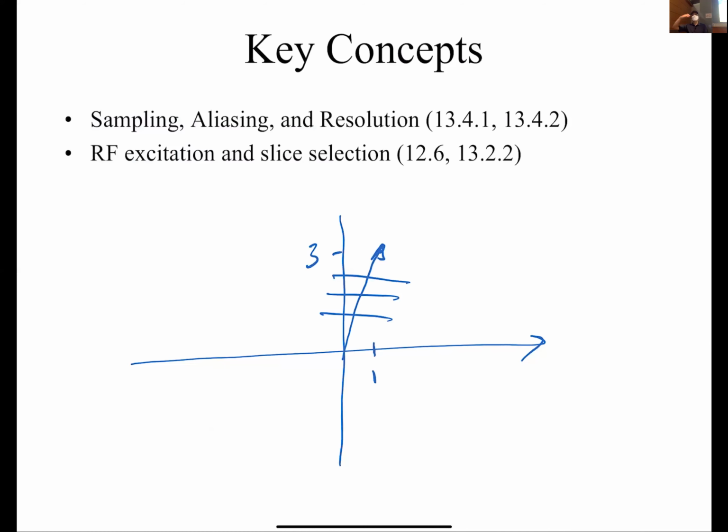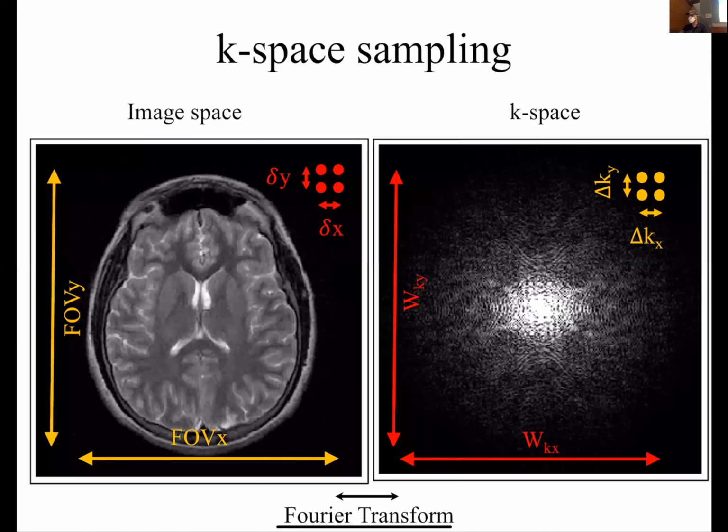That's not the right angle interference pattern that was in the image. So if you did not get that right, it's not a bad idea to plot where you are in K space, draw the perpendicular to that vector, and see what pattern you would have gotten. The other problems people did pretty well on, so I'm not going to go over those.